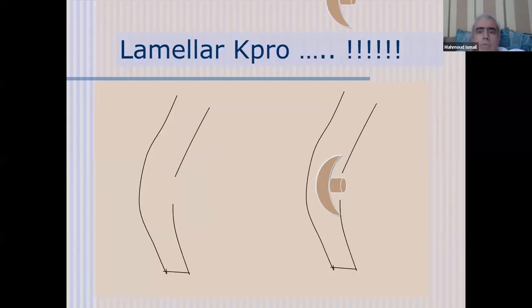The Boston keratoprosthesis is very well studied, but I would like to show you something very easy, Dr. Gustavo, a small piece of work that I have done after a number of years of trying several kinds of keratoprosthesis. Let me be honest with you, I have faced all the problems that you have bravely presented today. It is very honest of you to have presented every complication. And it's true: a high rate of glaucoma, retroprosthetic membrane, spontaneous infection, spontaneous melting, extrusion. I have seen them all.